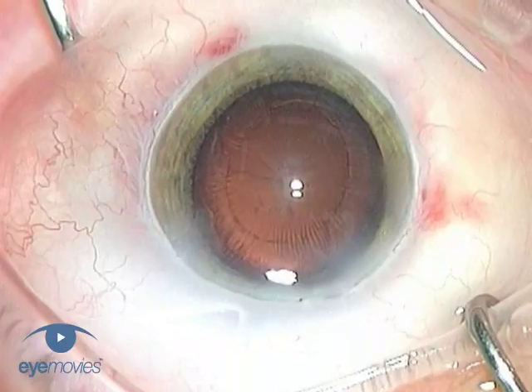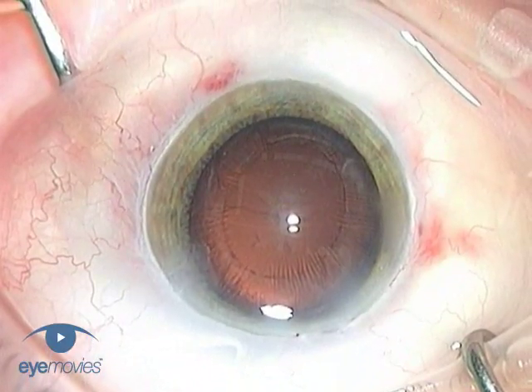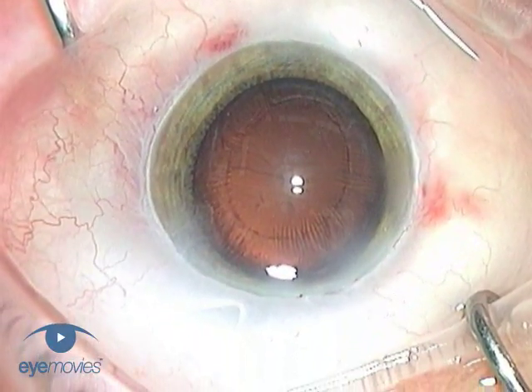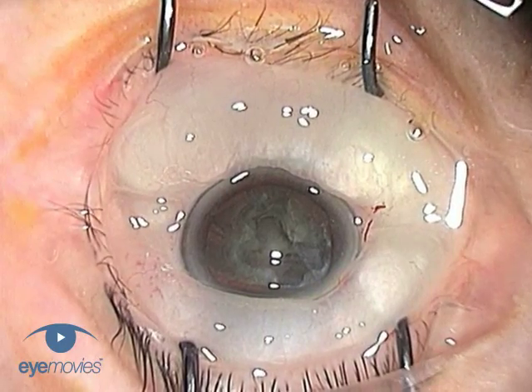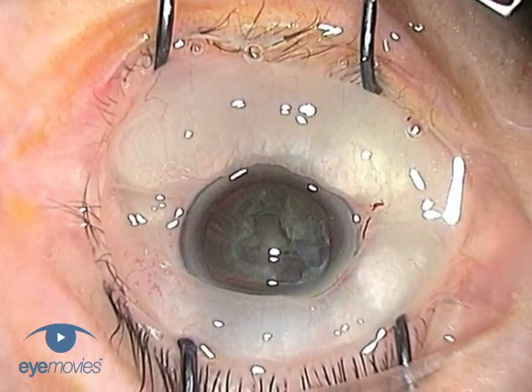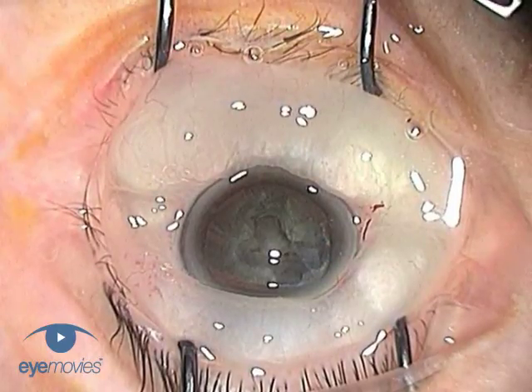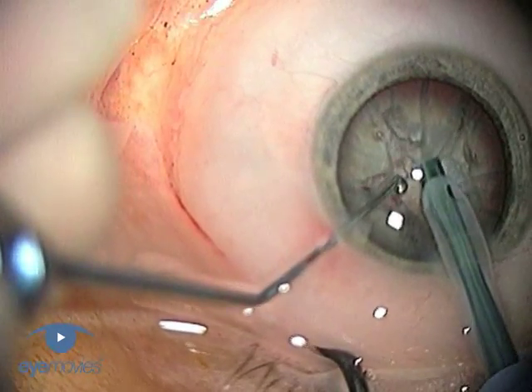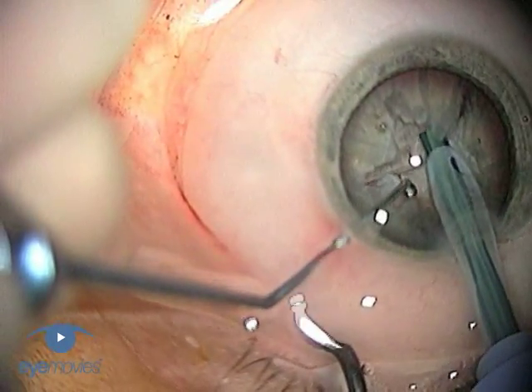Surgical chemosis is the term used to describe swelling of the conjunctiva. It is usually caused by the accumulation of subconjunctival fluid and most frequently occurs during cataract surgery.